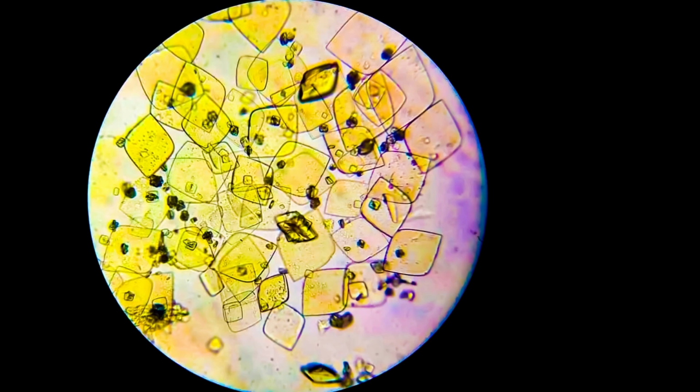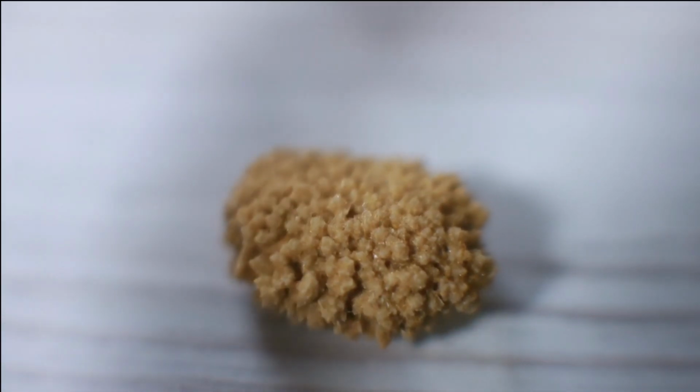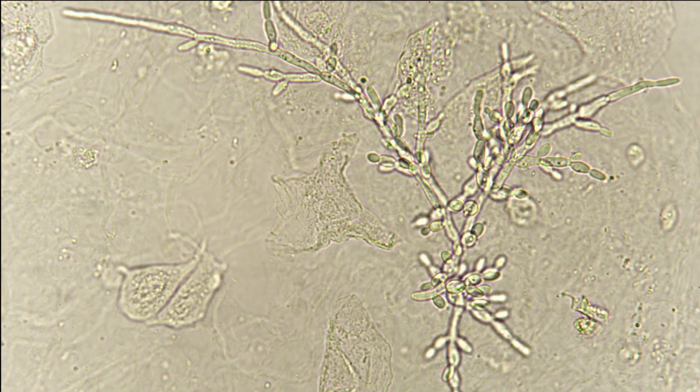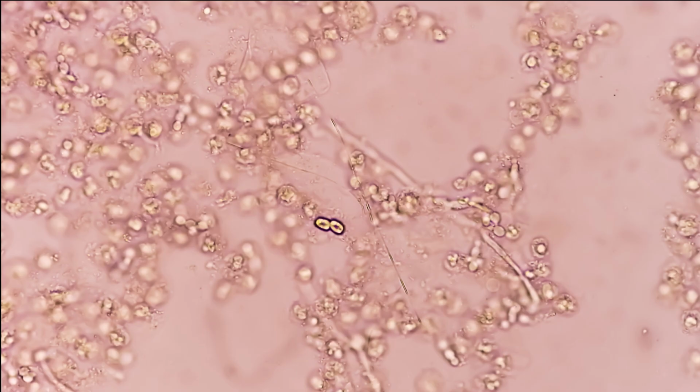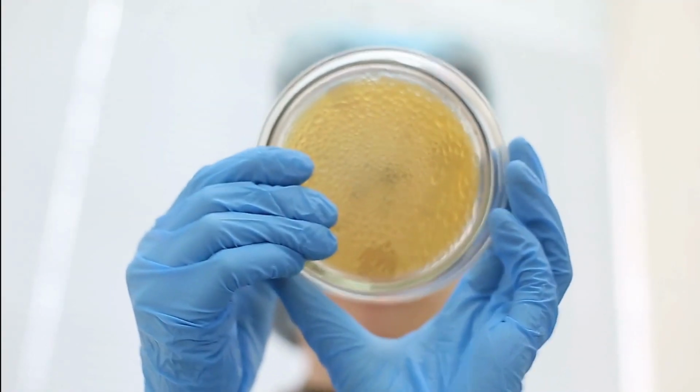Crystals can also be seen in a microscopic examination of the urine. The lab scientist can identify crystals such as calcium oxalate or uric acid crystals, and urinary crystals play a significant role in the formation of kidney stones. Lastly, we explore the presence of bacteria and yeast in urine, which could signal an infection. Identifying the specific microorganisms helps determine the appropriate treatment for the patient, and additional tests further enhance the accuracy of urinalysis results.